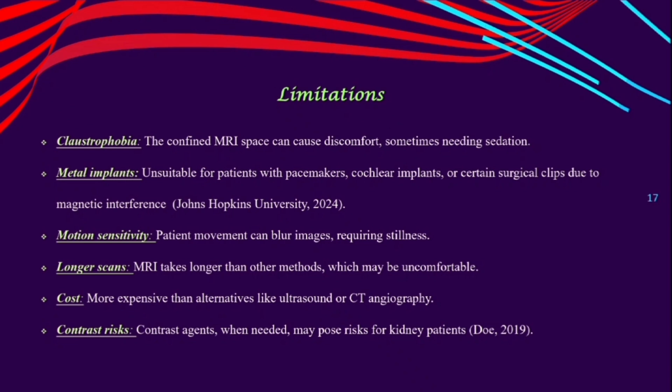Longer scans. MRI takes longer than other methods, which may be uncomfortable. Cost. It is more expensive than alternatives like ultrasound or CT angiography. Contrast risk. Contrast agents, when needed, may pose risks for kidney patients.